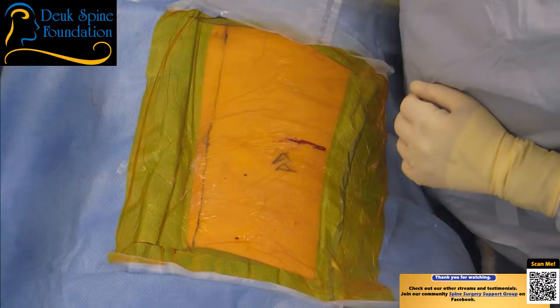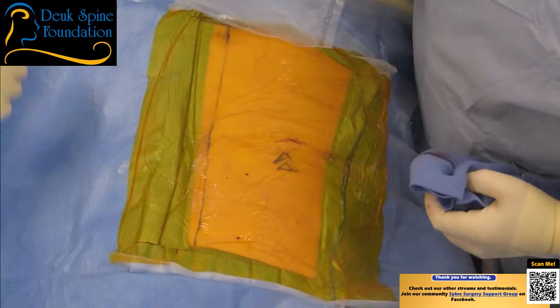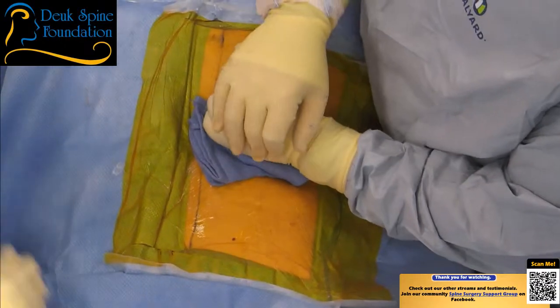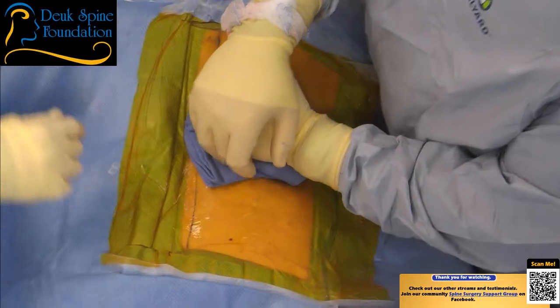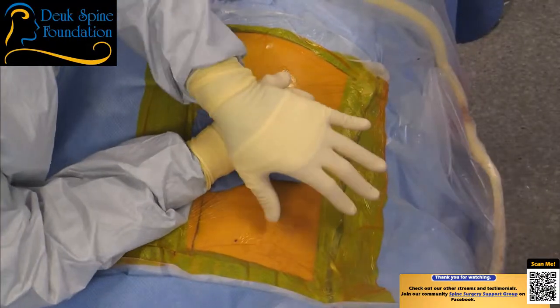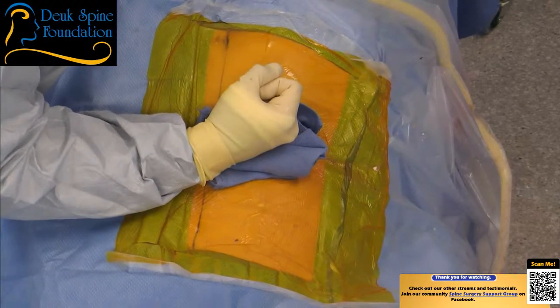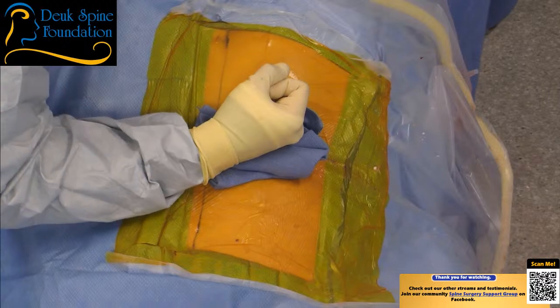So our incision today is, there's 50% of our blood loss right there. Our incision today is 1 centimeter, tiny. Did you guys see that, Sean? Yes, we did. All right, apply pressure, please. Great job, everyone. And she's going to go home an hour after recovering, rather than being laid up in bed for a few weeks because of pain from a fusion.